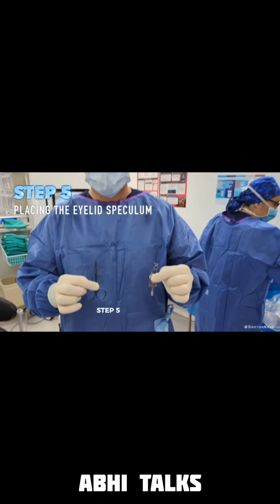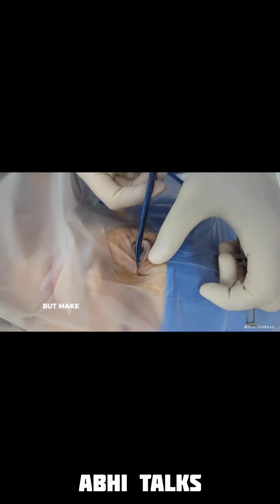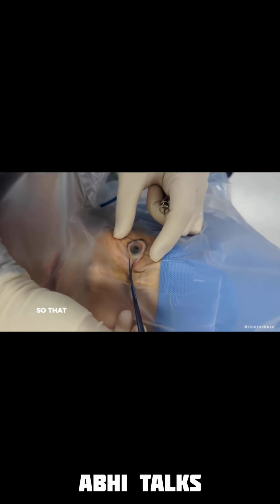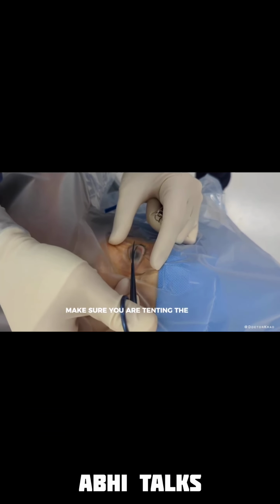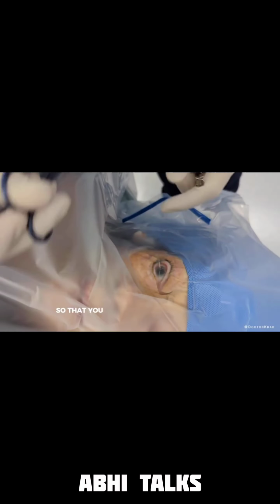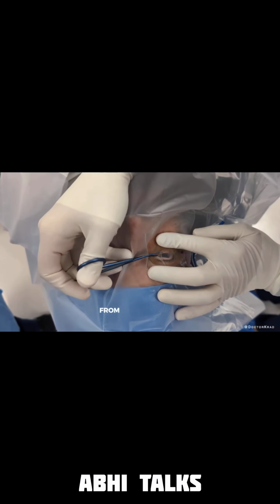Step 5. Grab the drape scissors and eyelid speculum. Cut a slit through the drape, but make sure you are watching the tip of your scissors so that you don't accidentally scratch the cornea. When you are over the cornea, make sure you are tenting the drape up and away from the cornea so that you don't accidentally scratch it. But don't tent it up too much because you don't want to remove the adhesive drape from the eyelid skin.